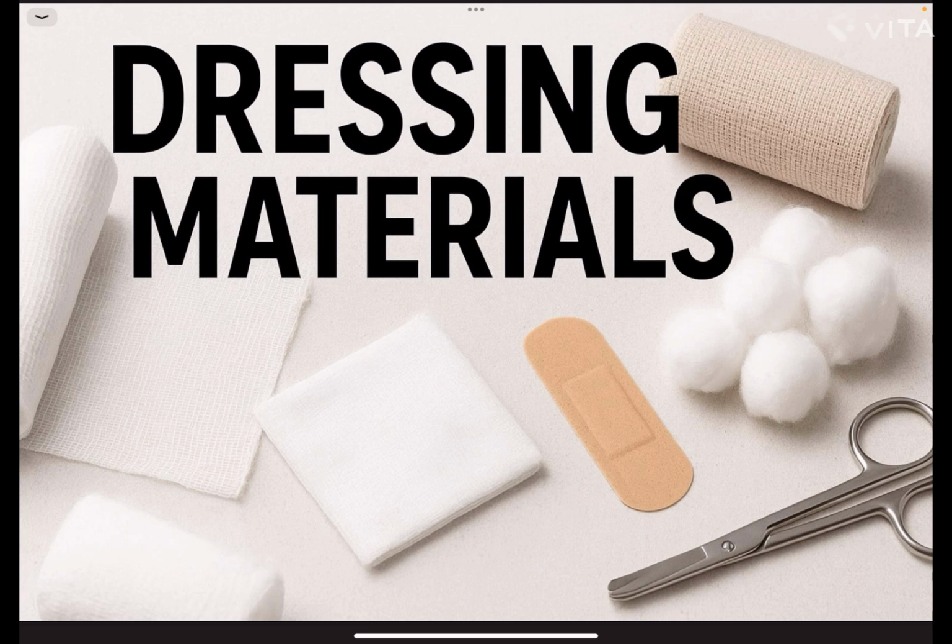Absorptive layer. After application of the contact layer, we apply dressing pads like Gamgee pad or thick gauze piece which are kept over the contact layer. They have absorbent property. One must remember that absorptive layer is the thickest layer of dressing.